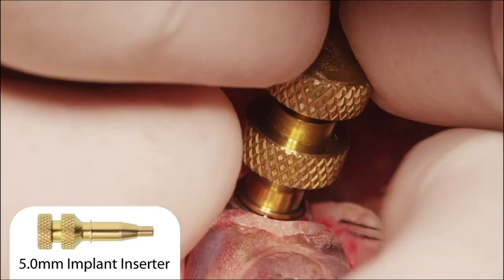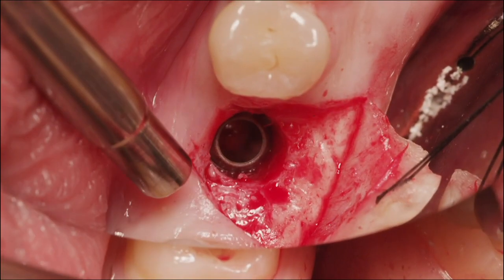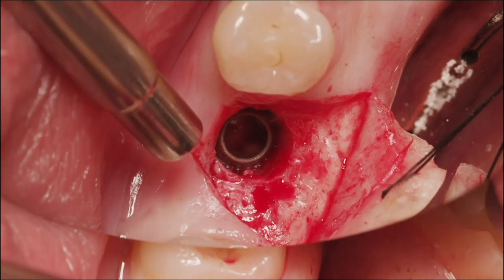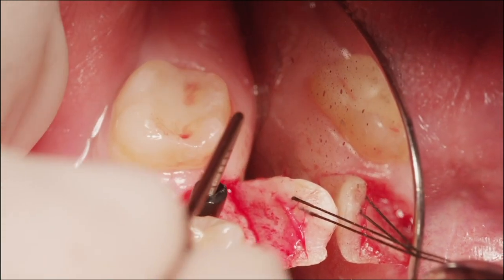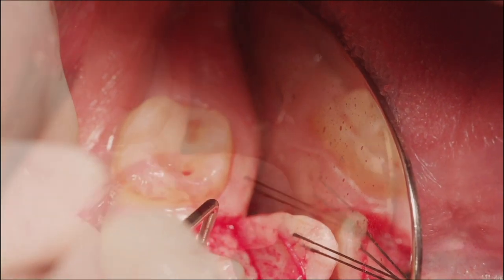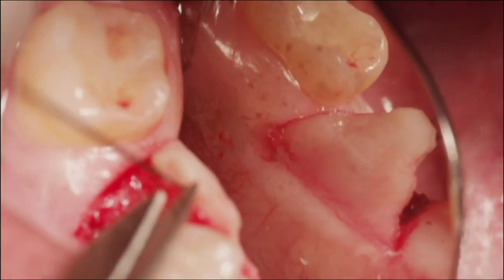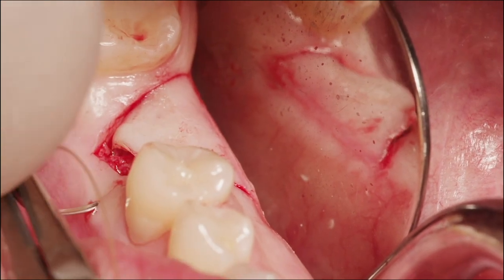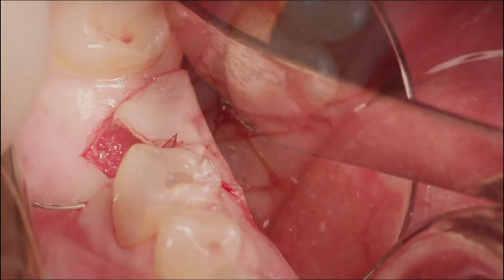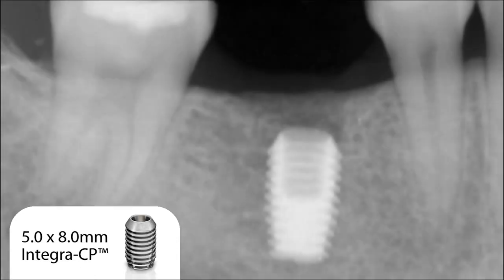Disengage the implant inserter and remove it. After removing the guide, a cut black healing plug is inserted into the well of the implant. The harvested bone, collected during reaming, is placed over the shoulder of the implant. The site is sutured and a radiograph is taken. This completes the demonstration for the two-stage placement of a short implant using Bicon's guided surgery kit.